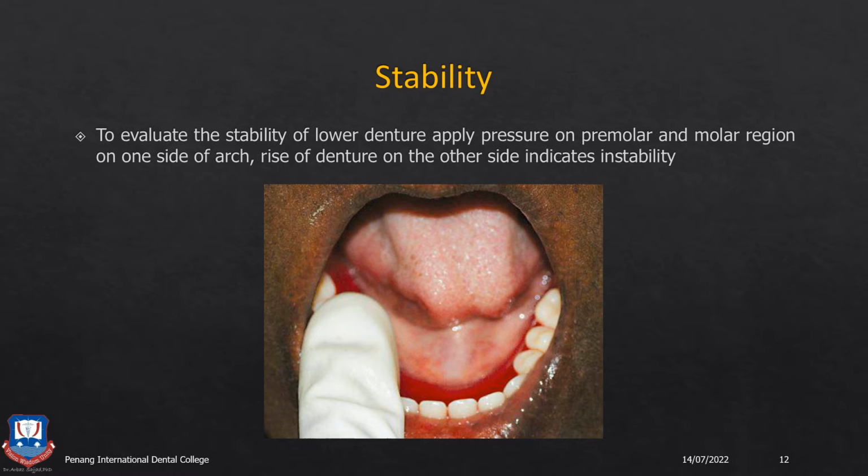Next, you come to the stability. To evaluate the stability of the lower denture, you place your fingers on both sides, on the posterior teeth, and try to tip the denture. That is, you press with one finger, lift it, then press with the other finger, and you check whether the denture rocks, lifts or tips. So this could indicate again either a poor record base, or a distorted base plate, or a loosely fitting record base, or it could also be that the posterior teeth are arranged buccal to the ridge, resulting in the instability of the denture. So then you have to arrange the teeth properly on the crest of the ridge.